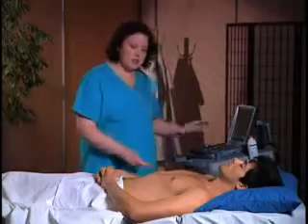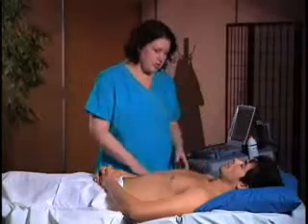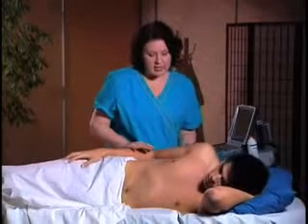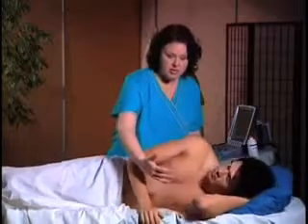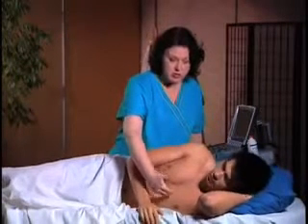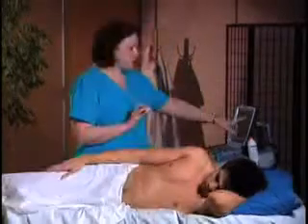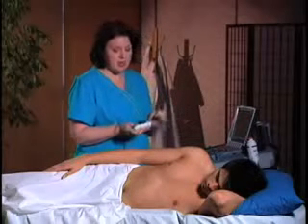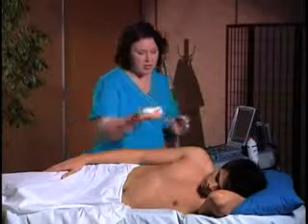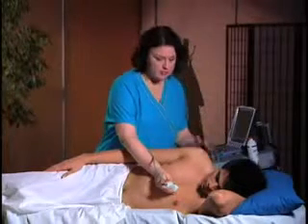Okay, so the first thing you're going to do with this, if you can, is have the patient turn over to their left side. The reason we like to do this is as you have the patient turn to their left, the heart's going to fall forward in the chest cavity and bring it a little bit closer to the window that you're trying to access through the ribs. So in this case, if we're doing a cardiac examination with a cardiac exam type, we want the orientation marker facing up to the patient's right shoulder.